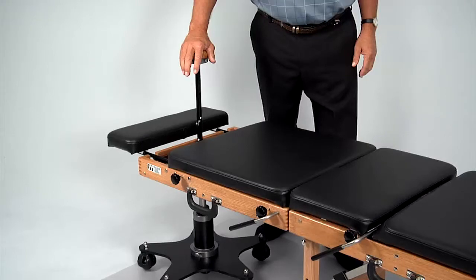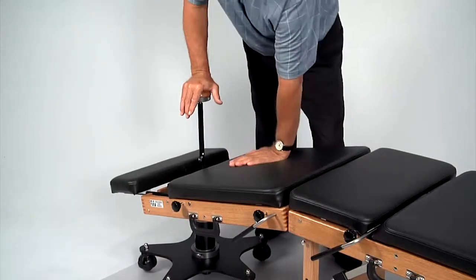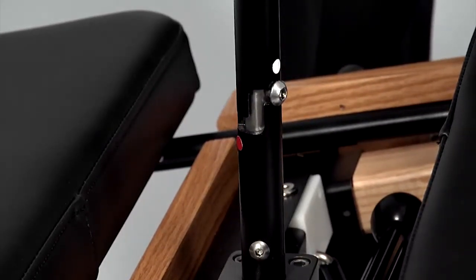The table can also be locked into any flexed position. Press down on the control knob with the button in the red position and use your other hand to hold the table at the desired angle. Turn the control knob to return the position indicator button to the white position.